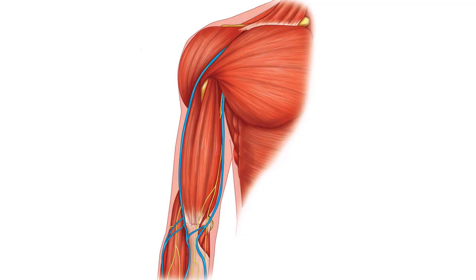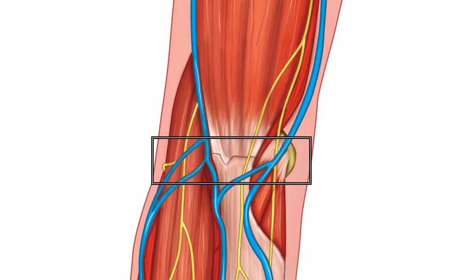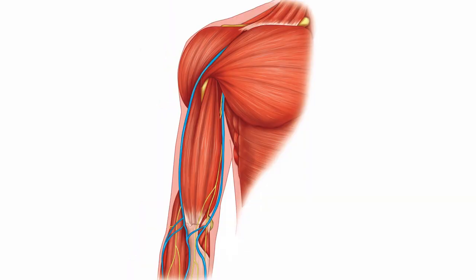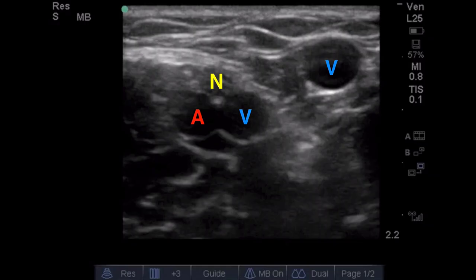What we're going to talk about is mapping out the vasculature to find an appropriate vessel. Starting in the antecubital fossa, you can track down for the forearm cephalic and basilic vessels, and track up for more proximal vessels. The preference is more distal over proximal vasculature, shallower vessels over deeper, and superficial vessels over deep vessels. Deep vessels carry a nerve in the neurovascular bundle, so you need to avoid it. Whether accessing a deep or superficial vessel, this should still be performed as a sterile procedure.